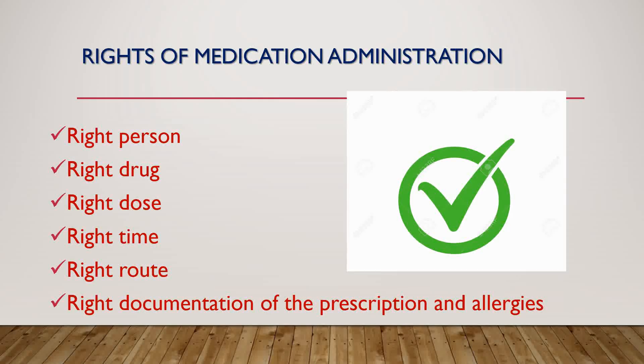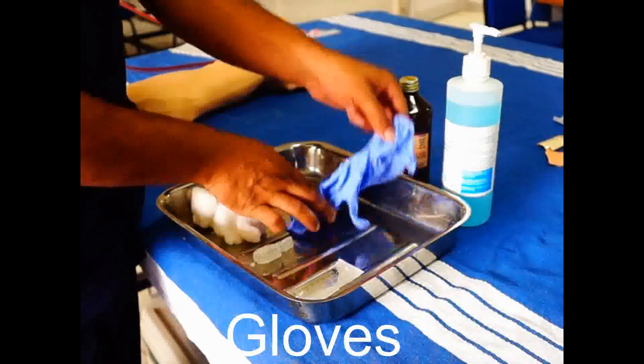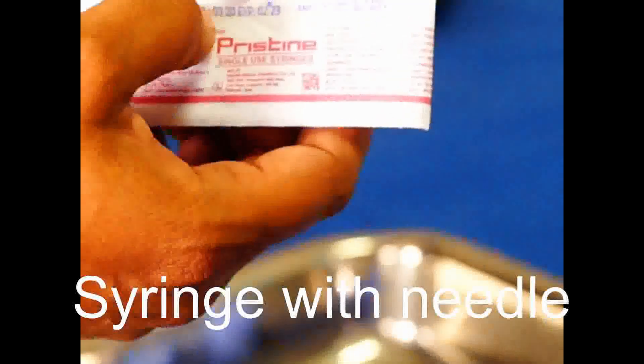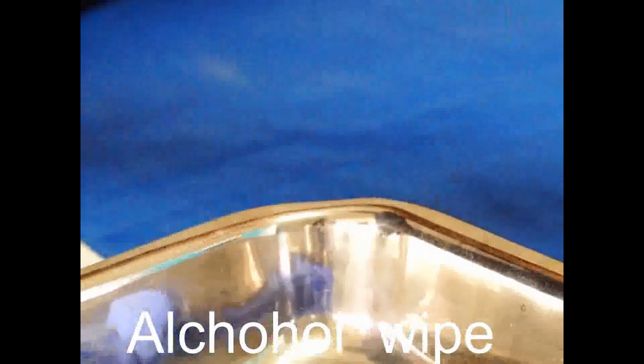Once all the above have been confirmed, prepare the medication. Equipment required includes a tray containing non-sterile gloves, a syringe with needle — use a small syringe and check the expiry date — the medication to be administered (sterile water is used here as a mannequin is being used), cotton swab or gauze, 70% isopropyl alcohol wipe, and hand sanitizer.